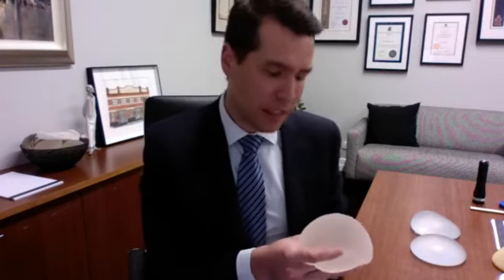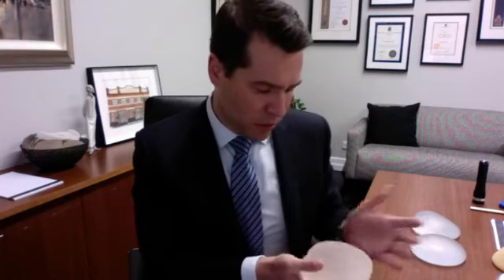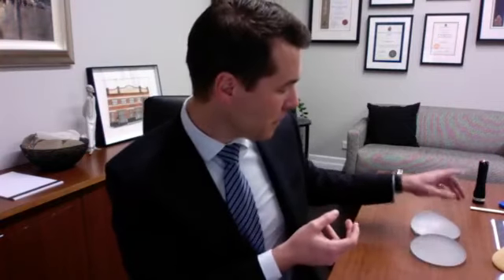But the micro textured Mentor implant is available on the market still. It's the same surface as what we use in the CPX4 tissue expander from Mentor. It's a good implant. We've been using it for many years. There's no particular concerns with that, but the ALCL risk profile of this is listed at 1 in 86,000. So it's a step down significantly from the grade 4 and grade 3 textured devices in terms of ALCL risk, sort of hovering from, as I said, 1 in 3,600 down to 1 in 86,000.